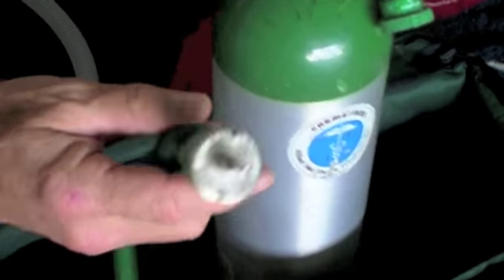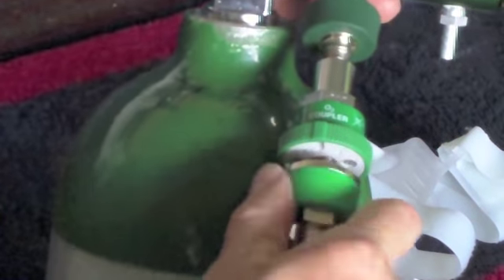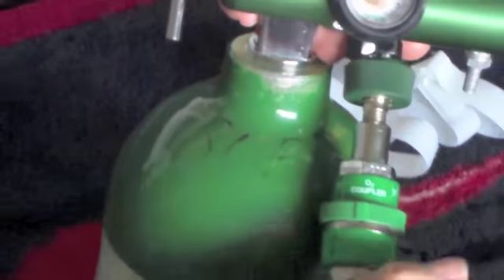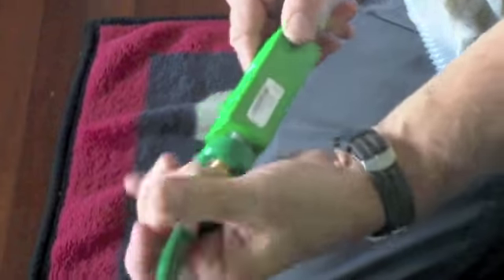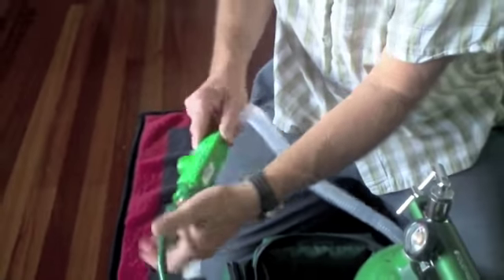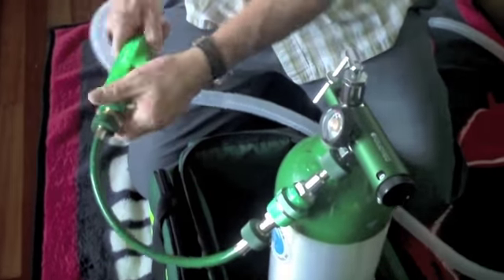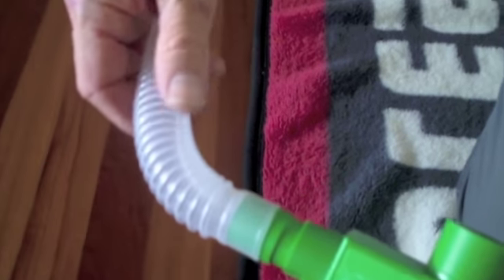Again, make sure that the holes are aligned and it will snap into place. From there, the tubing is attached to the CPAP generator. Make sure that all the connections are tight. The corrugated tubing goes onto the CPAP generator, which is attached to the CPAP mask.